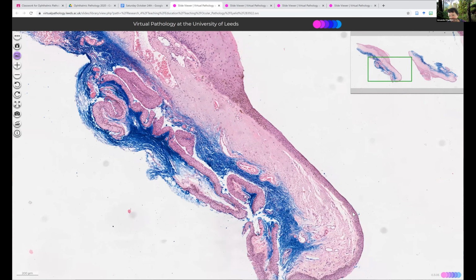Okay, so I can see in the center there is an expansion of the epidermis to at least 5 times the thickness of what I think should be the normal area. And let's have a look at the components of this. It still looks to be squamous cells.